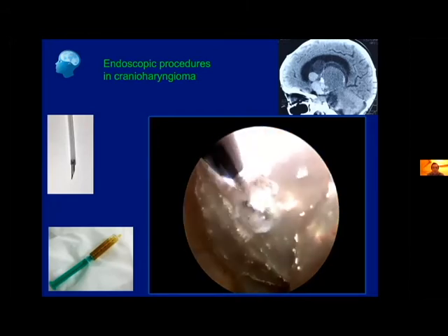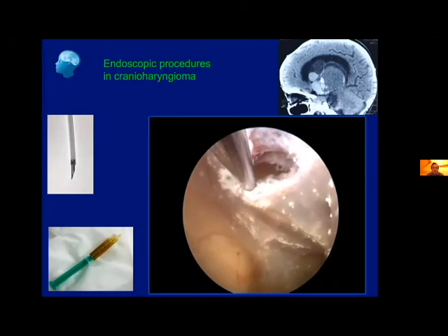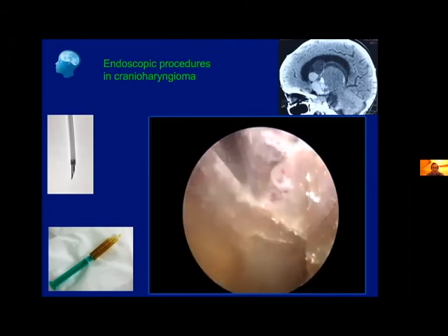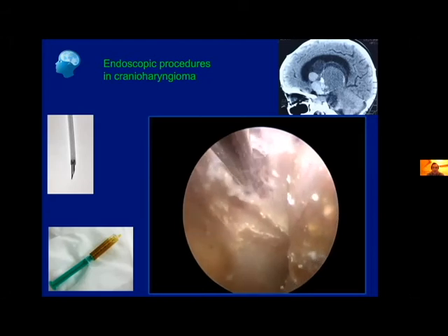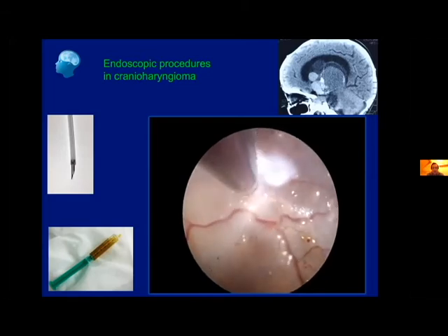So, in this video, you see step by step when we penetrate, when we evacuate the contents of these cysts. But pay attention that during this procedure, you should keep in mind the balance between the irrigation and aspiration. We use the aspiration of these cysts in the water environment. So we shall keep in mind the balance of the intracranial pressure.